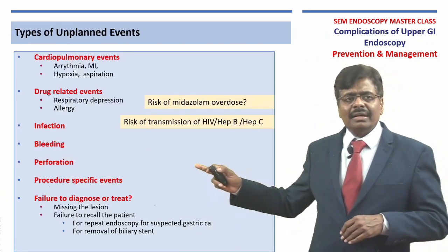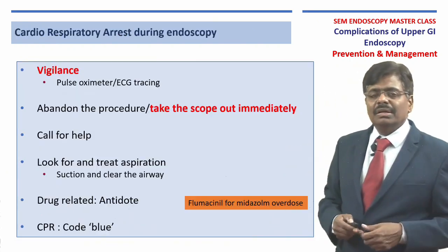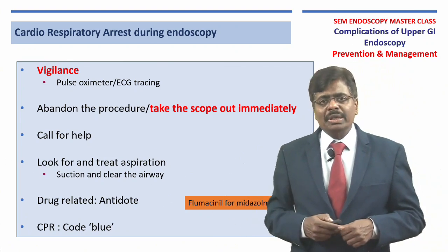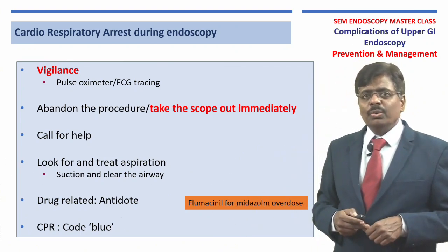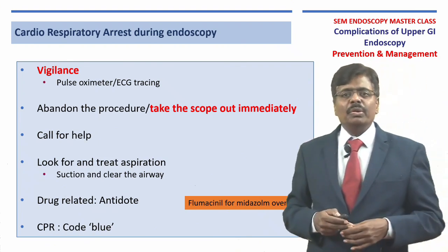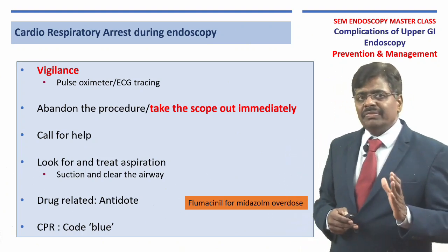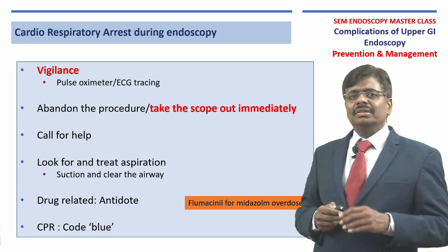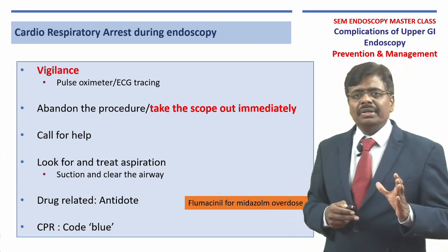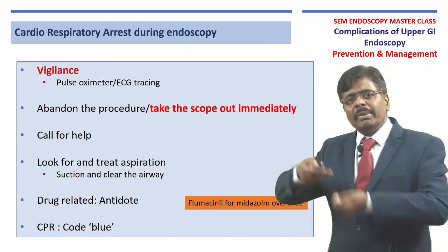Coming to the other, more common or more serious complications like cardiac arrest, bleeding and perforation. Coming to the cardiorespiratory arrest, very often you glue yourself to the monitor, you forget about your patient. Never do that, always keep an eye on the patient. If the patient is very quiet, you have to alert and you have to teach our staff to be very vigilant.